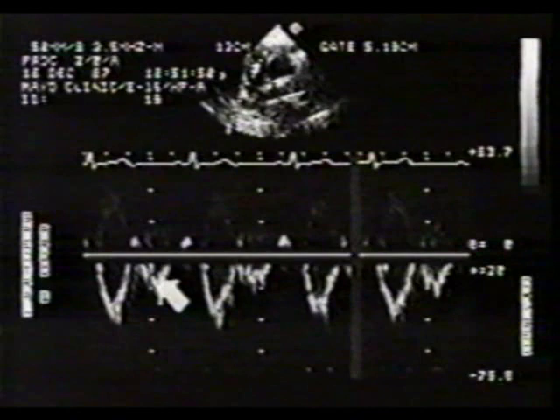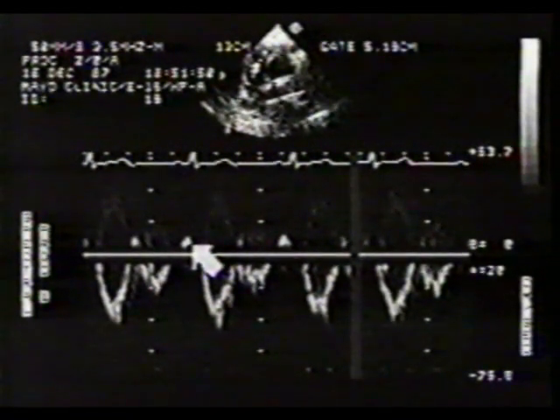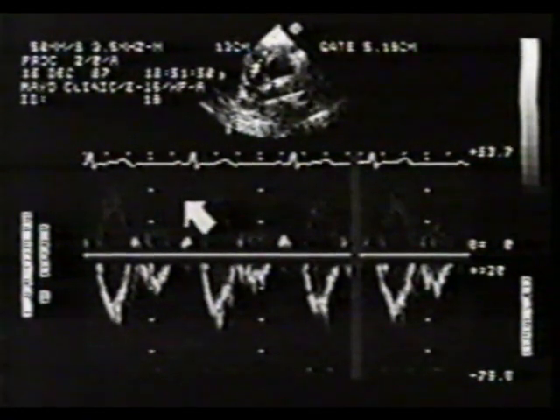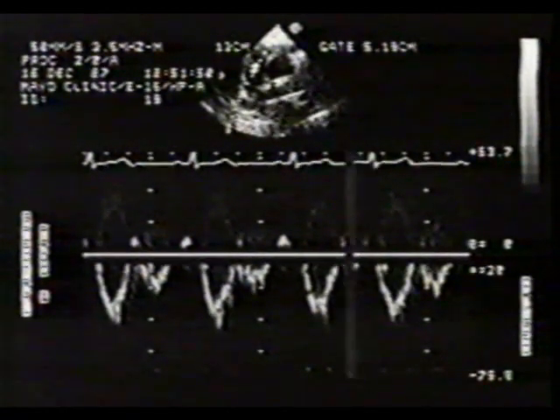The diastolic flow toward the right atrium, here 0.2 meters per second, occurs with opening of the tricuspid valve. This late diastolic reversal is an A wave. It follows the P wave on the electrocardiogram, and it is generated by right atrial contraction. In the real-time examination, you will note variation in the velocity contour due to respiration, with increased flow velocities noted during inspiration.